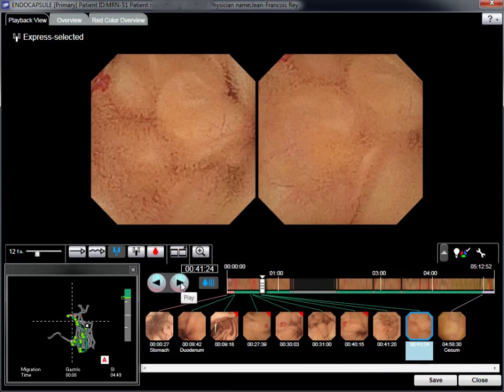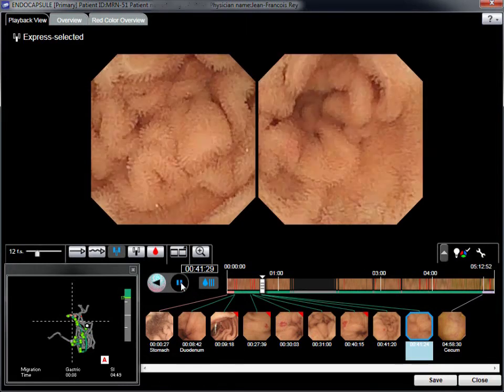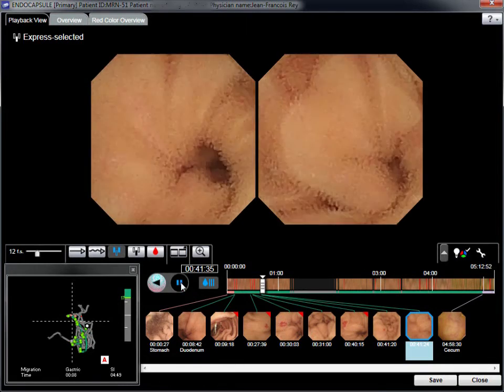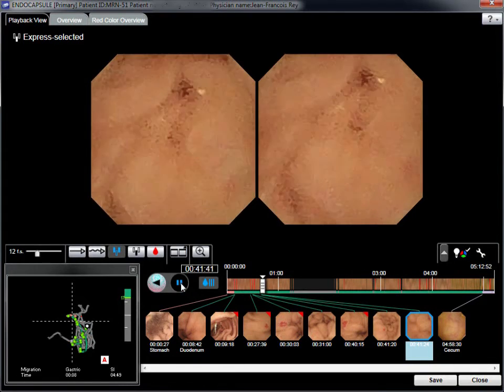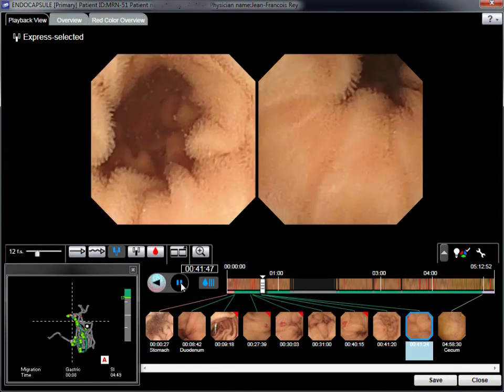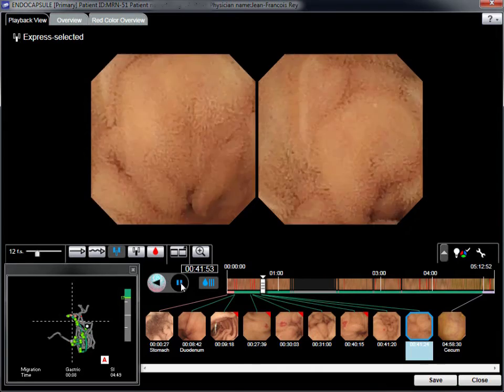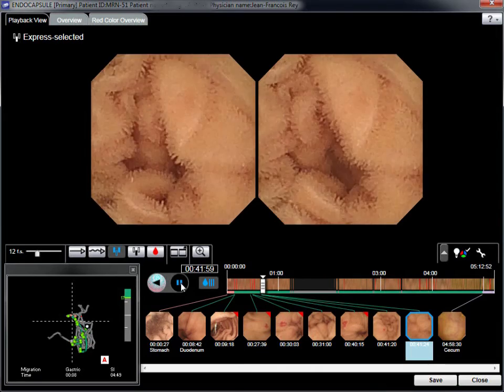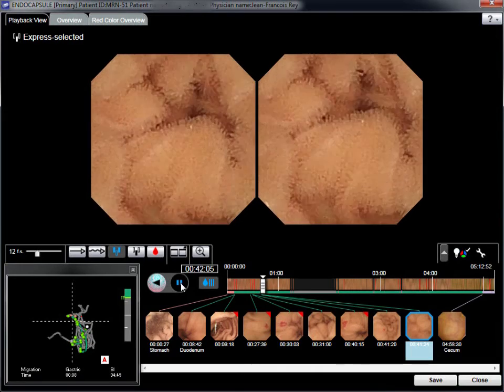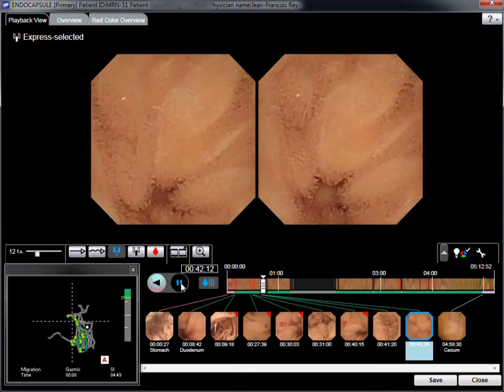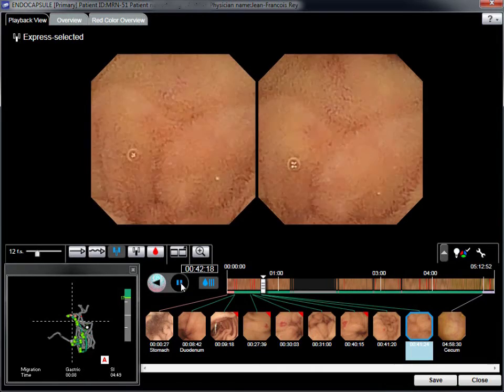As reviewing the video can rapidly become boring, it is wise to stop the video frequently and to use the software video function in order to avoid missing important pictures.